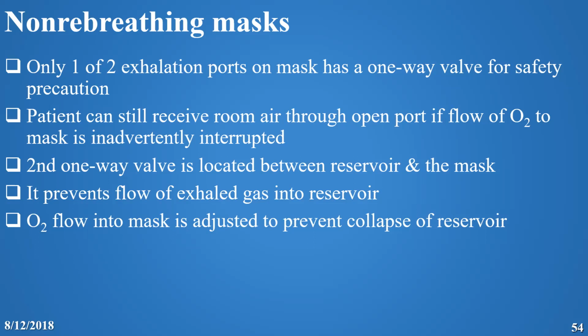It prevents the flow of exhaled gas from the patient to the reservoir, and therefore it prevents the mixed CO2 gas from going to the reservoir, and therefore allows the reservoir to always give fresh air and fresh oxygen.